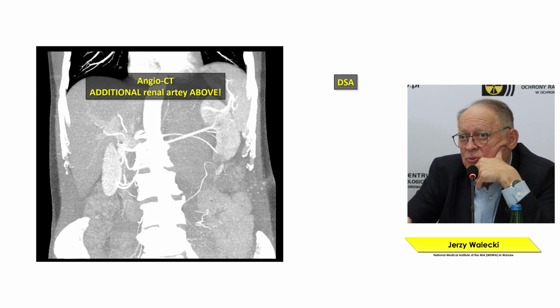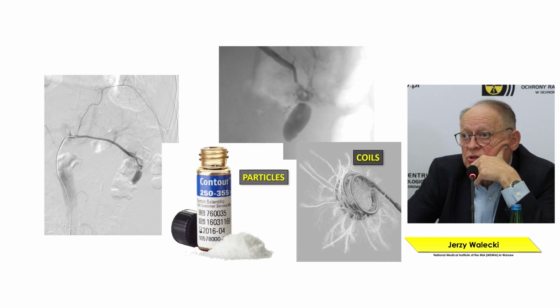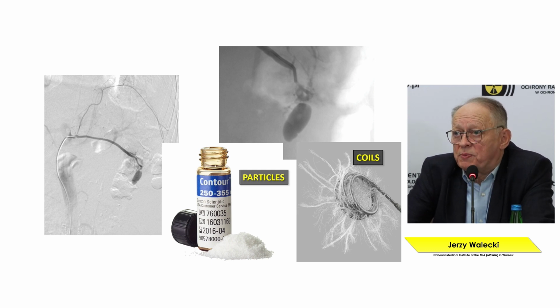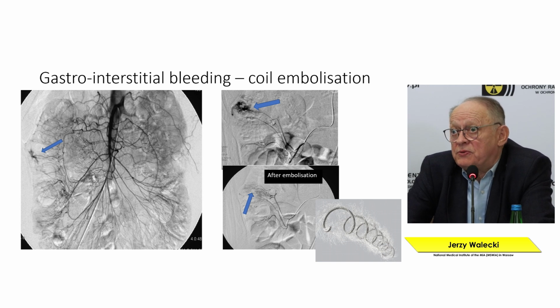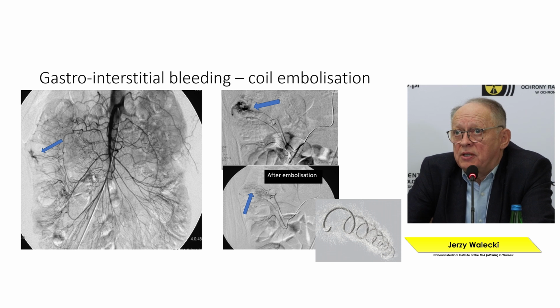Using the CT scan, we extended the procedure, but we knew that we had to occlude the lumen of this kidney artery, and we did it. Here you can see the coils and particles of a preparation that led to embolization. I'm just about to complete my presentation. Here you can see lots of different uses.